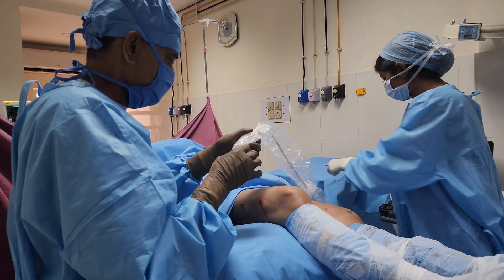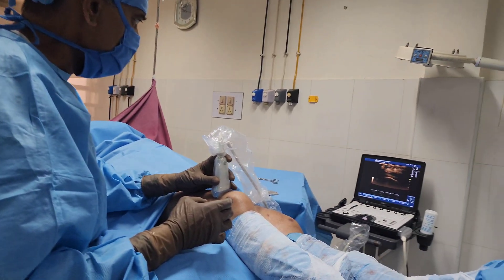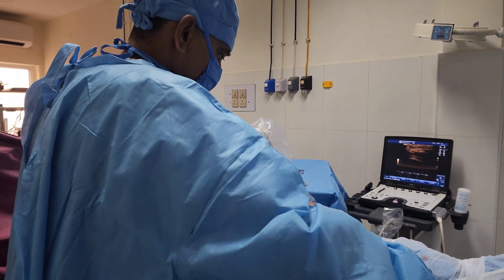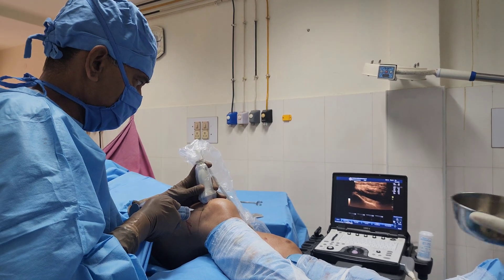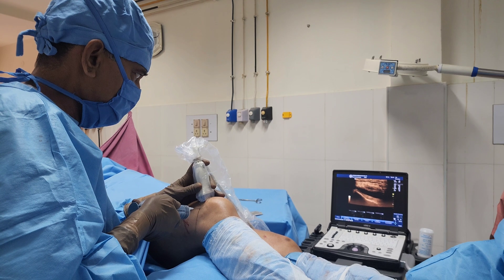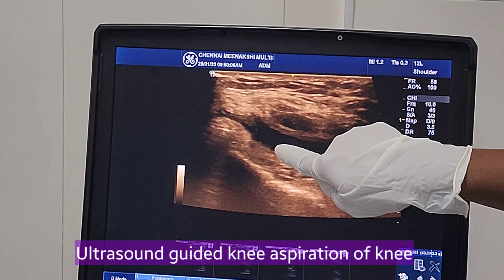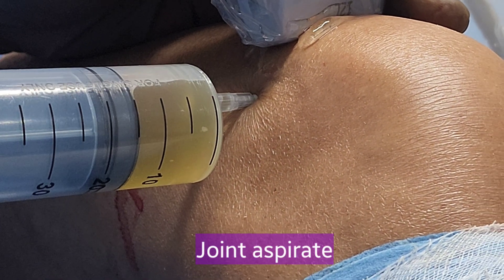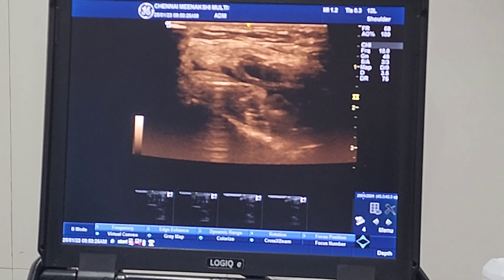Now we have the ultrasound probe and I am going to place it over the knee. I am inserting the needle. The needle is inside the effusion. Now I am aspirating fluid. Fluid is coming out easily and you can see the knee effusion is getting empty.